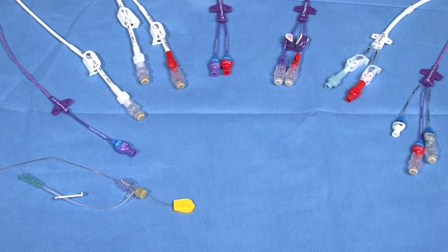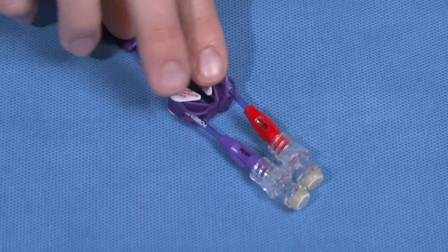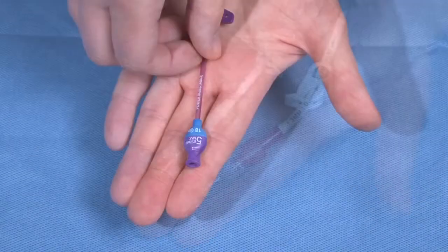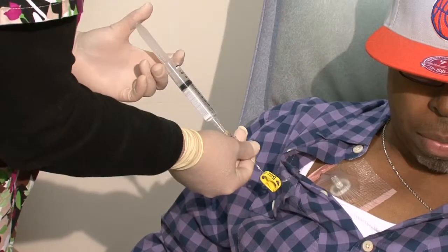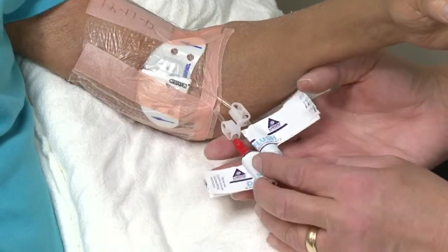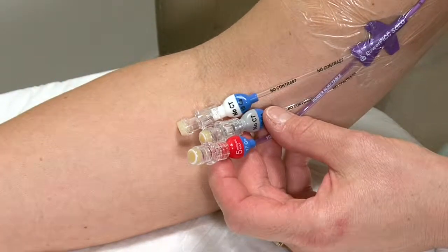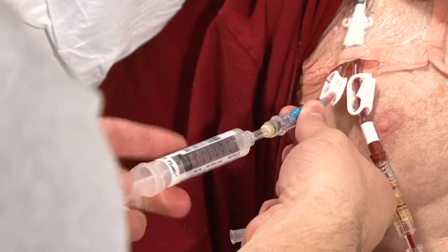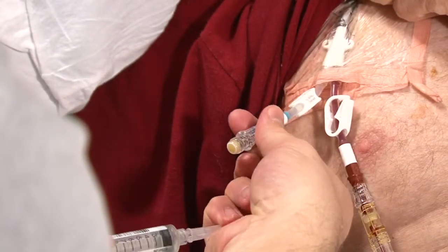Even though there are different types of central lines, they have a lot in common. First, the catheter will have one or more openings called lumens. This is where medications, fluids, or nutrients will be given to you so they can enter your bloodstream. Some catheters have 1, 2, or 3 lumens. A single lumen catheter only has one opening at the end of the catheter that all fluids or medications will be given through. Catheters with 2 openings, called double lumen catheters, and 3 openings, called triple lumen catheters, are used when a patient needs to receive multiple medications, fluids, or nutrients that are not allowed to mix with one another. Separate openings allow different medications or fluids to be given at the same time.